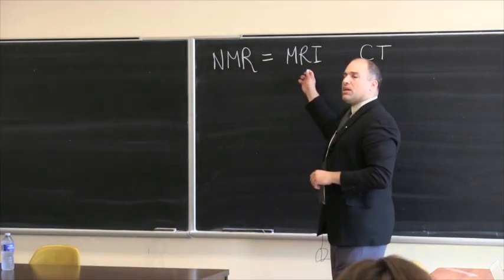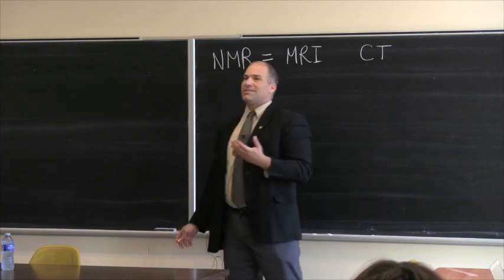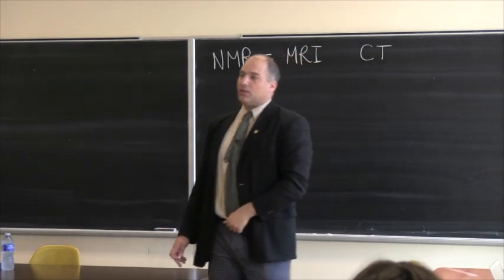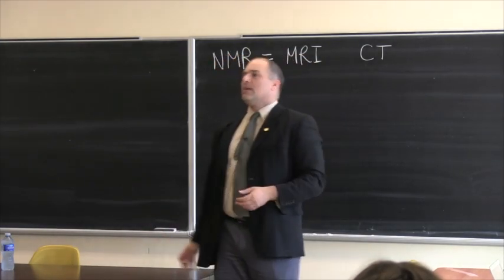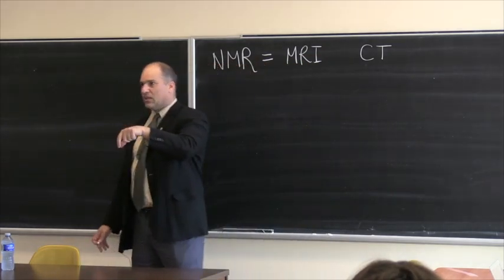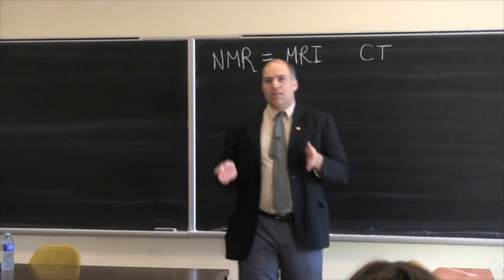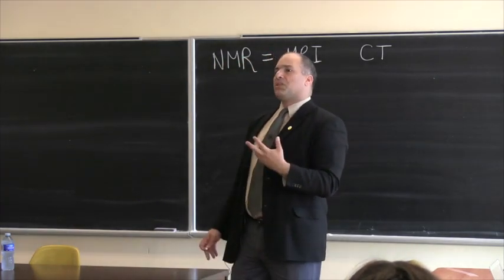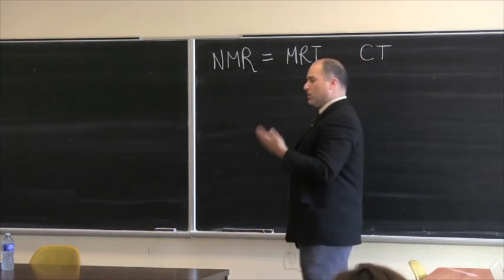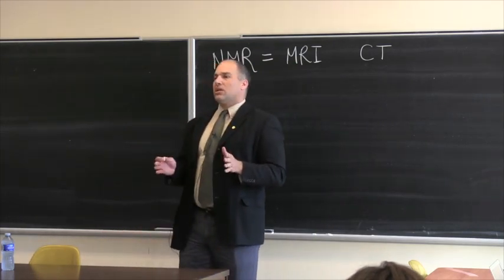But when we're talking about an MRI, we're talking about a machine that induces a magnetic field that is much stronger than that of the Earth. The magnetic field of the Earth we don't really feel, or at least we're not consciously cognizant of it. Of course, if you have a compass, that can detect it a little bit because the compass has a magnet in it. But if you amplify that field, there are electromagnetic ways to create that. When you create that field, it's very important that it is very stable and homogeneous and all kinds of other words that the MRI physicists use. And we have the technology today to do it.